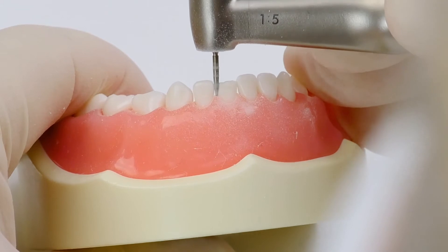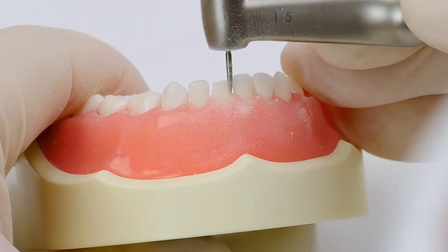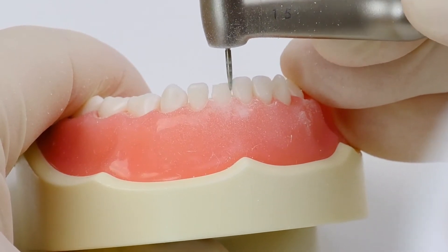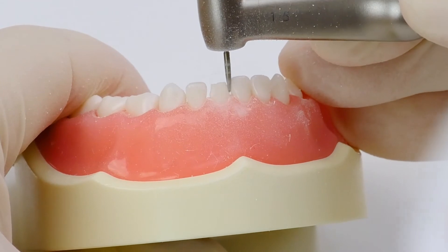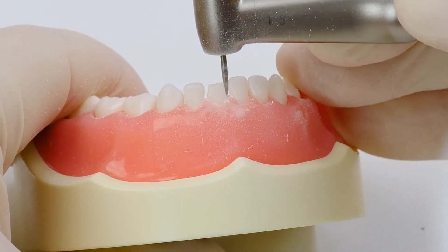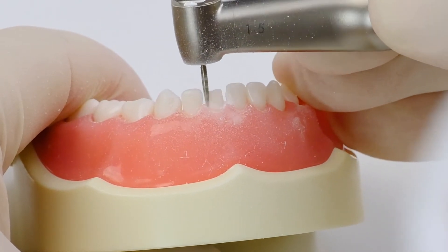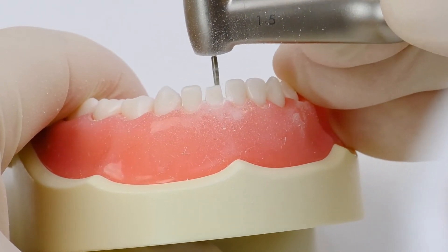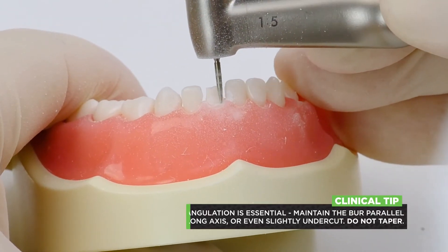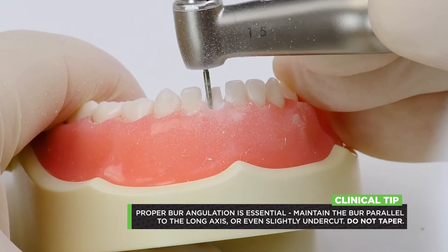For your axial reduction, I like to break contact so that I can do a nice circumferential reduction. I'll go in and break contacts, being careful not to nick the adjacent teeth if possible — this is really one of my favorite preps. Once I have that done, I go around the tooth to do my axial reduction. Key point: you want to keep your burr straight up and down; you really don't want any taper, same as with all the teeth.